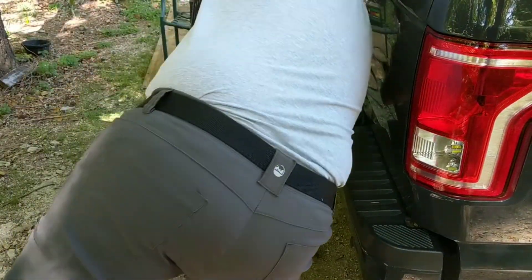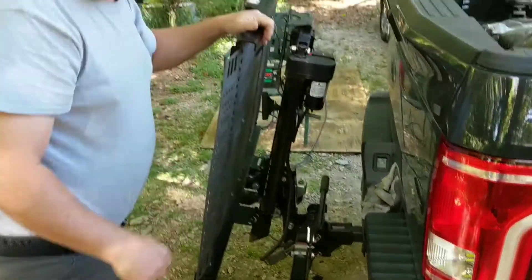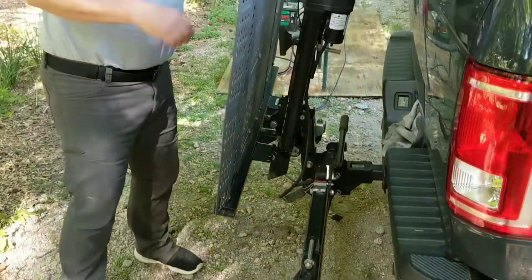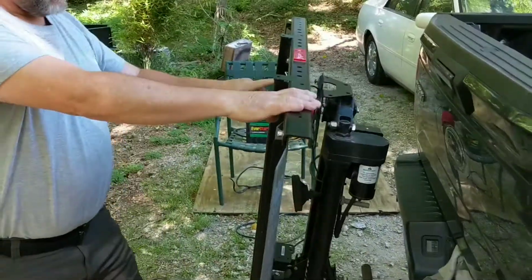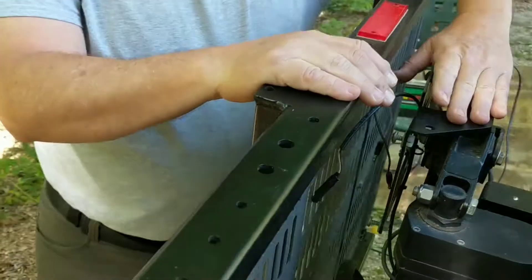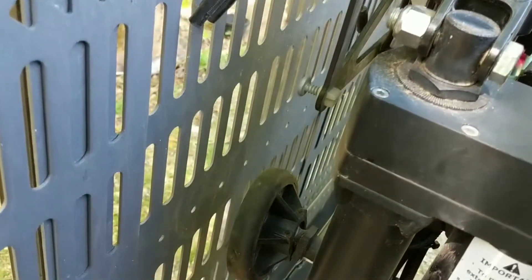Slot it back into position. It also has a trailer wiring harness, which includes at least a license plate light and probably your tail lights as well. There is also a mount for your license plate tag so that it's visible when you're driving.